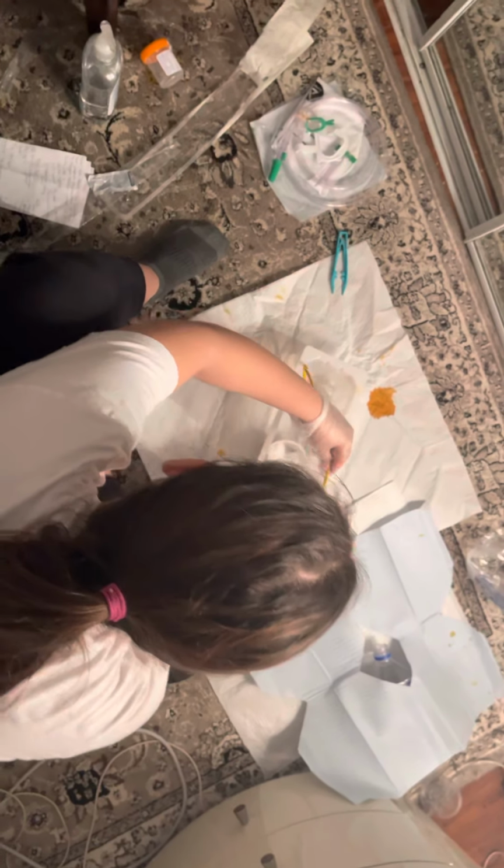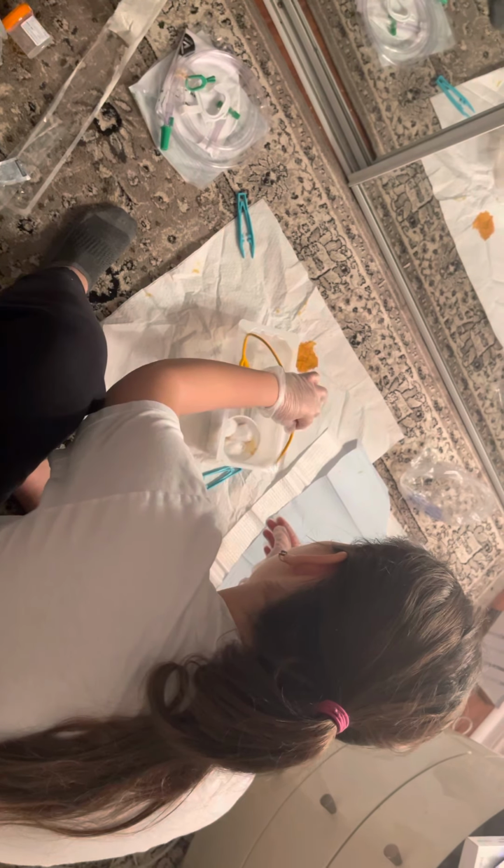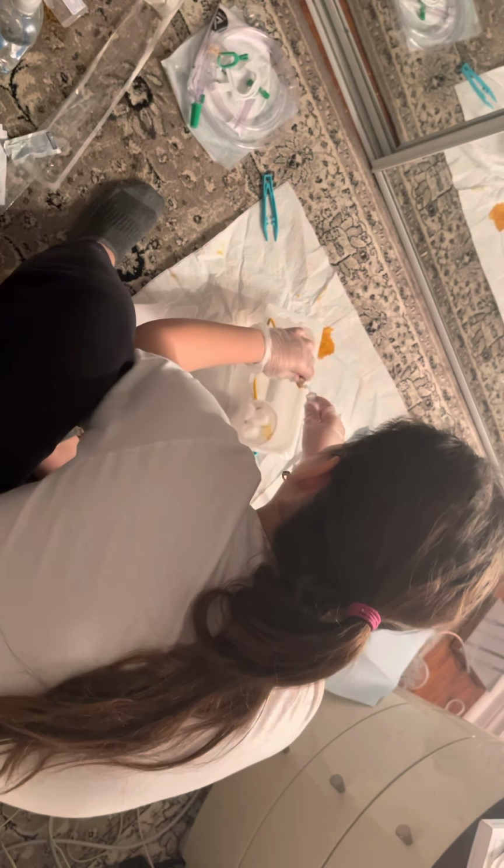I'm going to lubricate the catheter with the proper amount, as well as attaching my inflation syringe to the inflation cord. So I'm preparing my environment basically. I'm also going to place my forceps in here.